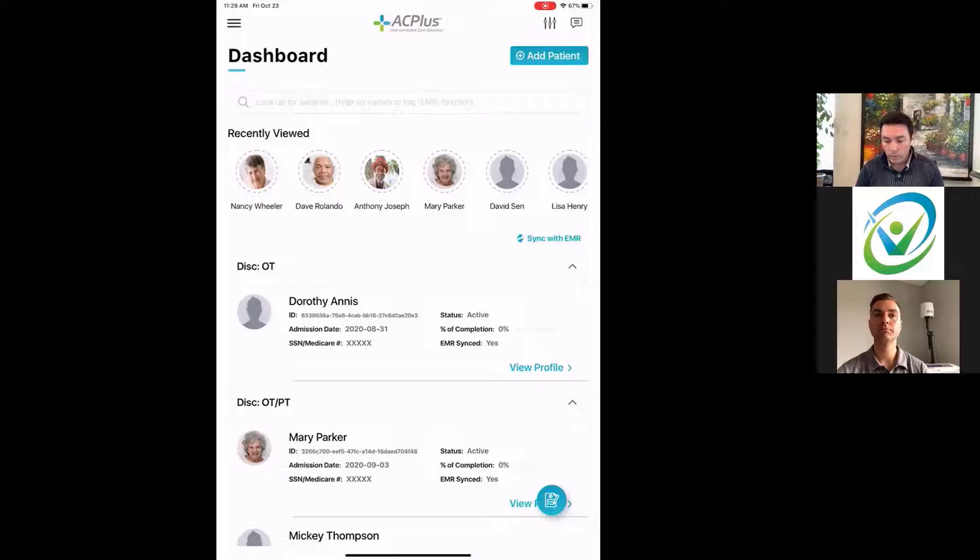Opening the AC Plus application, you land in a dashboard where patients are pulled directly from the EMR system — the system of record. Hitting the Sync button pulls all patient information into a viewable format on the tablet. You can choose which patient or discipline you're working with, continue documentation on the tablet, and when finished, transmit everything right back to the EMR system.